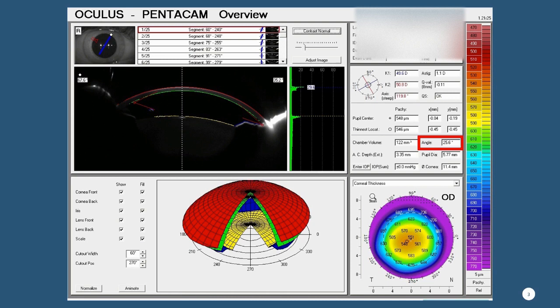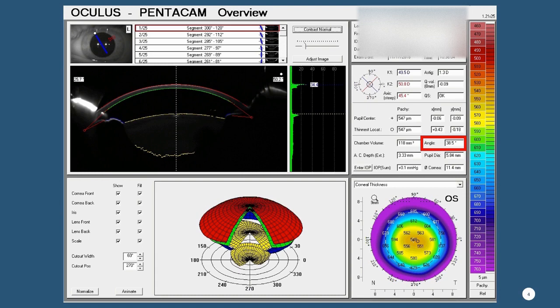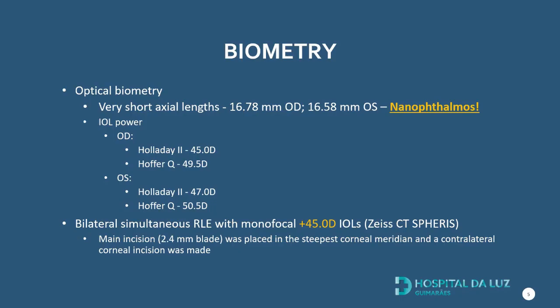The patient underwent further examination with corneal tomography that revealed very steep corneas, normal anterior chamber angle, no evidence of corneal ectasia and acceptable angle alpha profiles. Optical biometry revealed very short axial lengths, compatible with nanophthalmos. The results of the calculation formulas varied wildly.